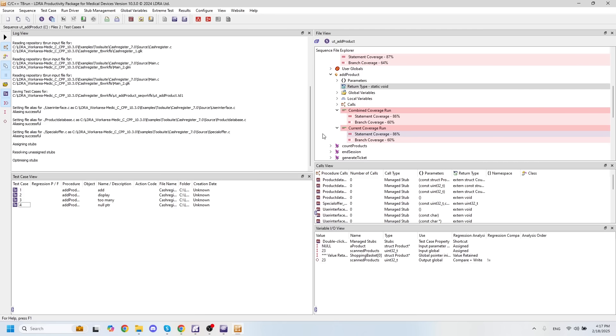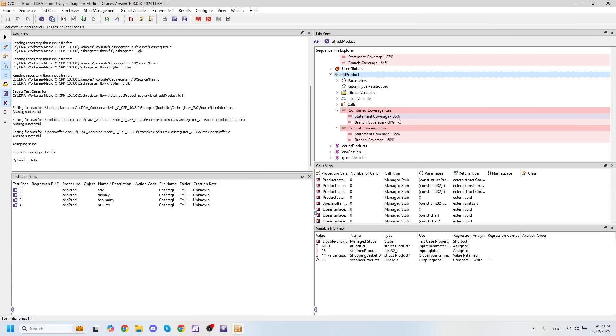In my case, I'm going to run some test cases on the function add product here. And once we're finished, we should see 100% statement and 100% branch decision coverage. And if not, then we know we need to create some more test cases. So I'll run my test cases here.